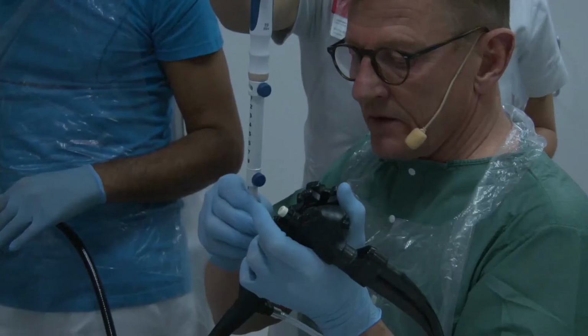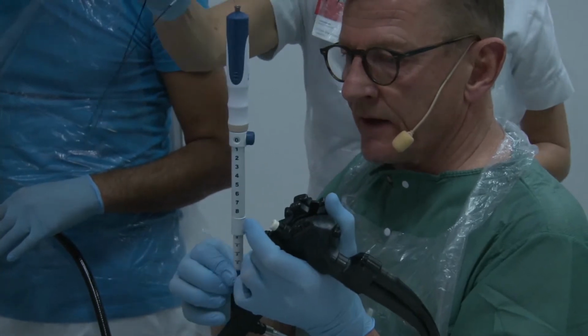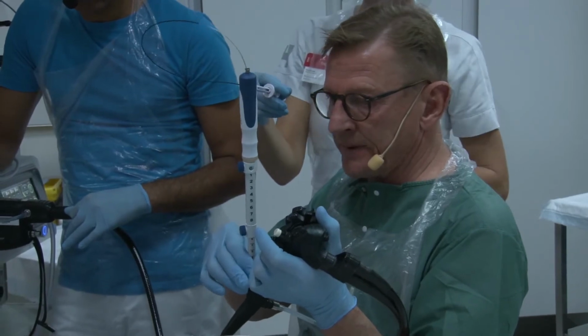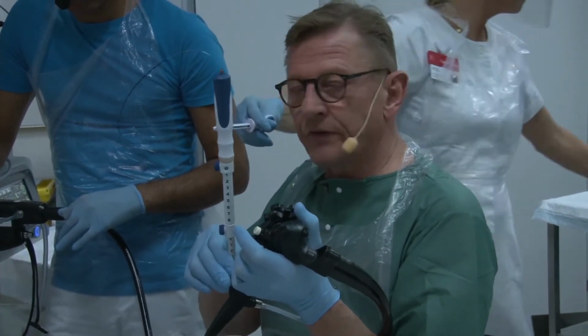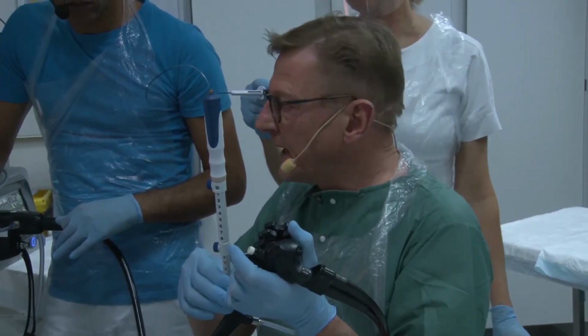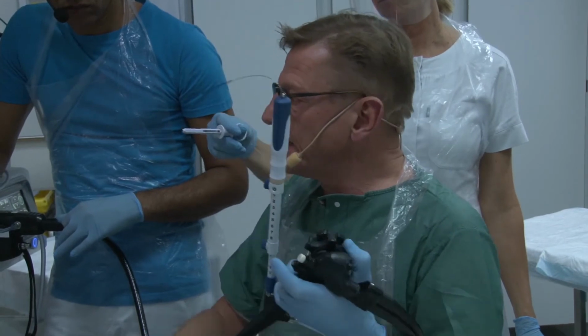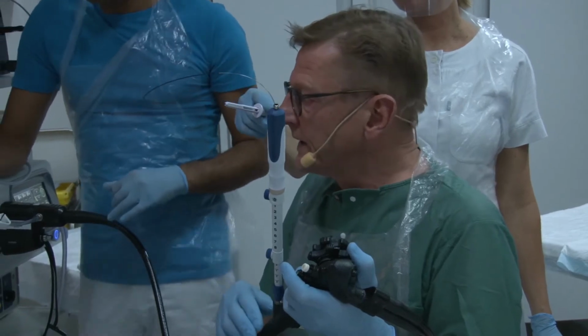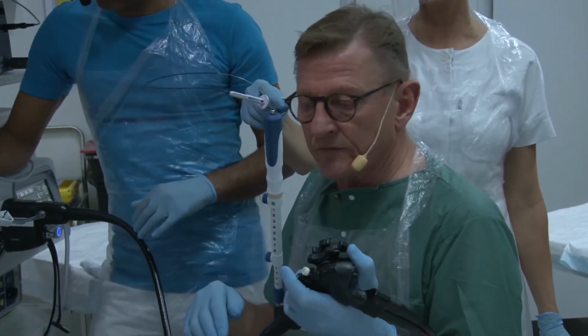Are you going to use it in all the cases or only indeterminate cases of EUS-FNA cytology analysis, or what do you think are the indications nowadays? You know, right now it's a matter of getting information, and it's now in a PhD study, and for the final questions we will not have an answer right now, but I see we are able to change the decisions at the multidisciplinary conferences in about 14% of the cases.